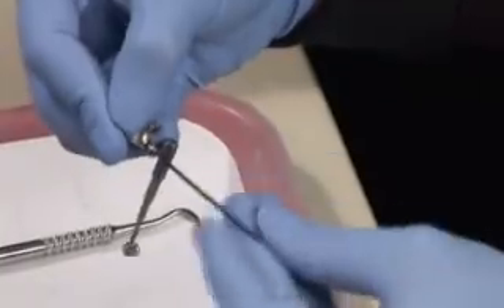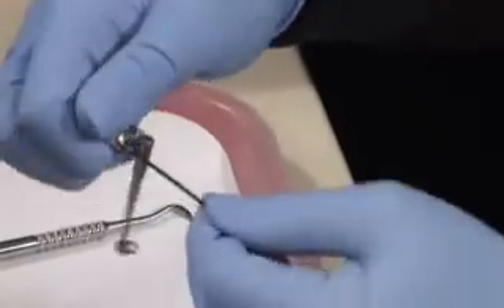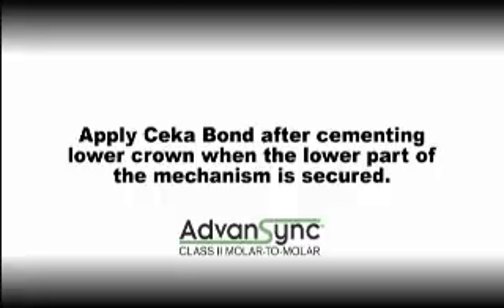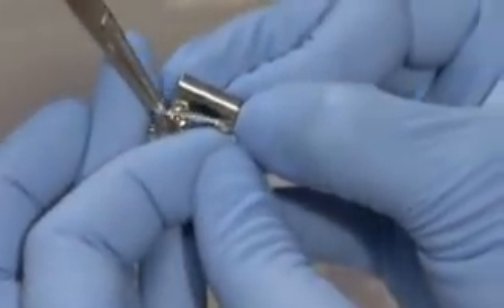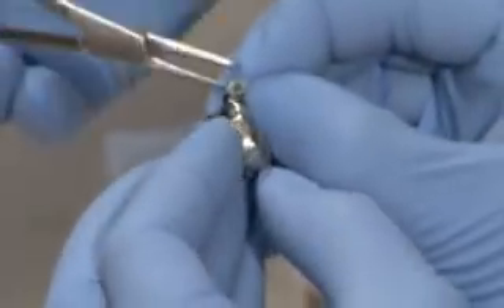It's easier to place screws in the upper mechanism before cementation. Apply Cicabond to the lower screw after cementation of the lower crown when the lower part of the mechanism is secured. Prevent the mechanism from getting in the way during delivery by holding it up and out of the way with a rubber band. Thread the rubber band halfway through the lower eyelet and collapse the extended telescoping arm into itself, keeping the mechanism very short.